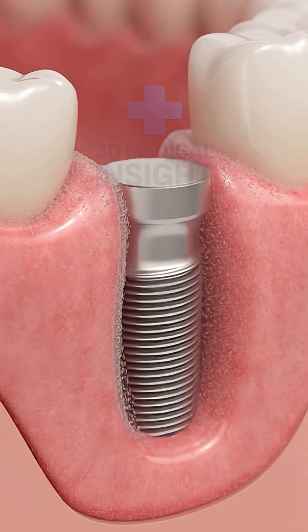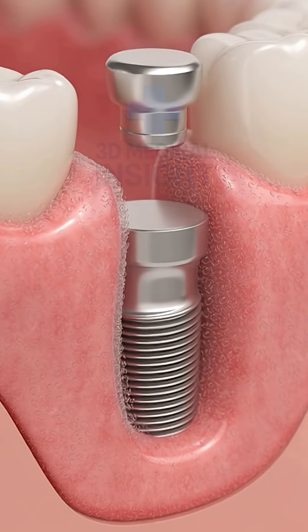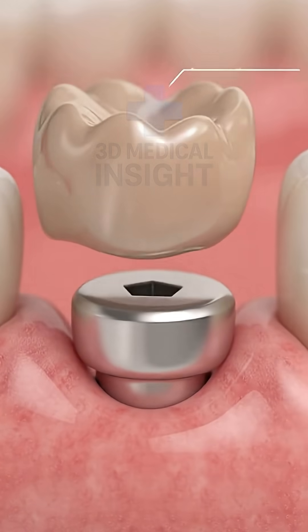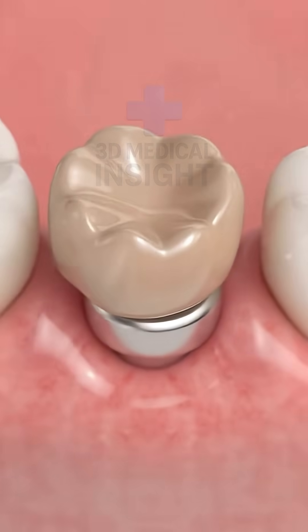A titanium base is secured inside the bone to support the new tooth. This new foundation begins bonding naturally with the bone.